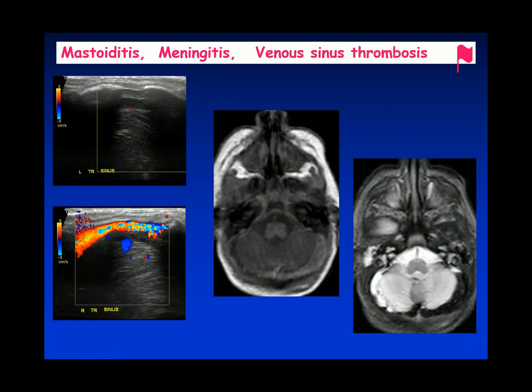As I told you, we use a lot of ultrasound, and in order to have our state-of-the-art technique, we use color Doppler. Okay? And this child was having mastoiditis, and he presented with findings of meningitis. So my first step was not to go into the MRI. I took the baby and I went to the ultrasound suite, and I did an ultrasound coupled to color Doppler, and I tried to see the different sinuses.